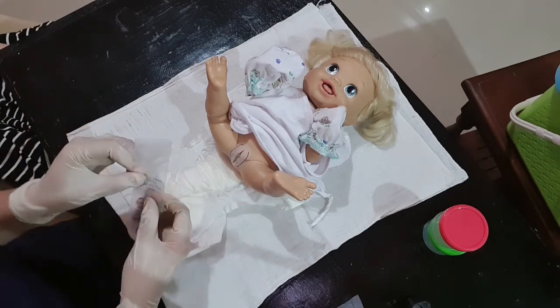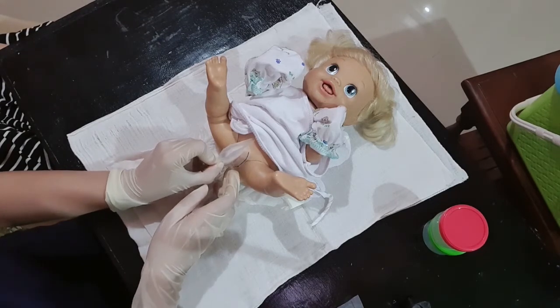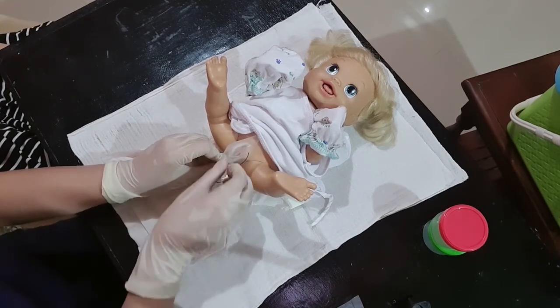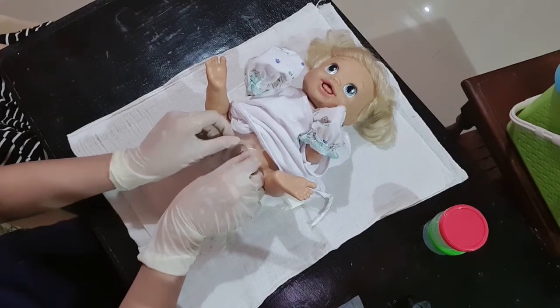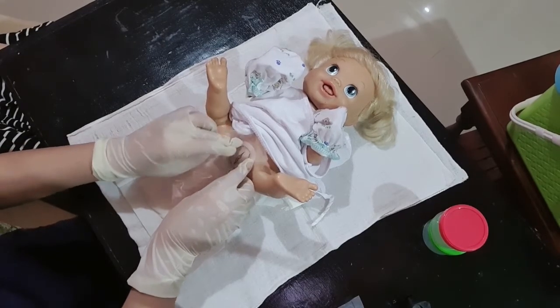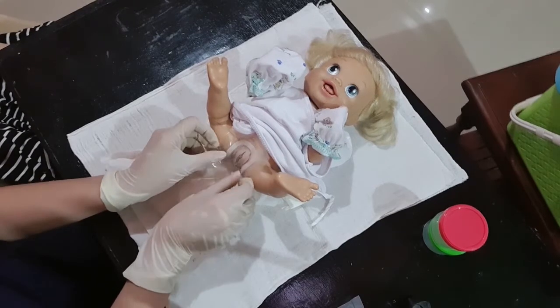Now, I will press it near the anus, going up, then spread, and I will press the adhesive firmly against the infant's skin.